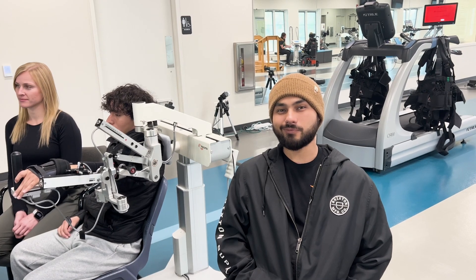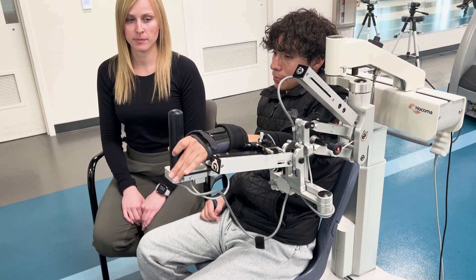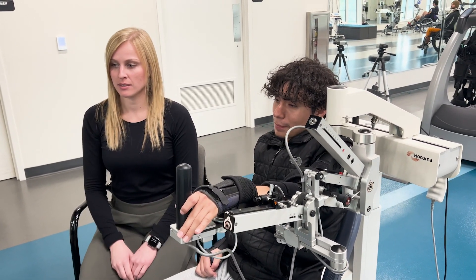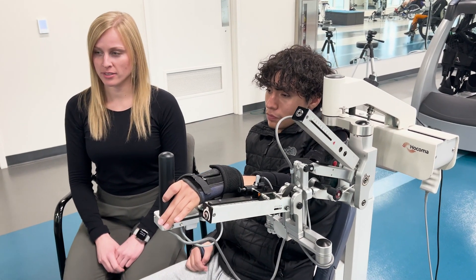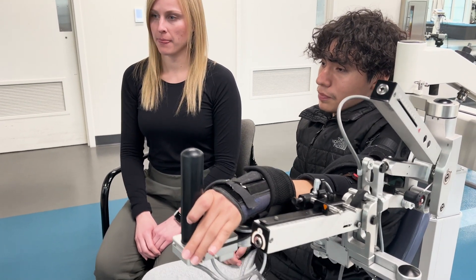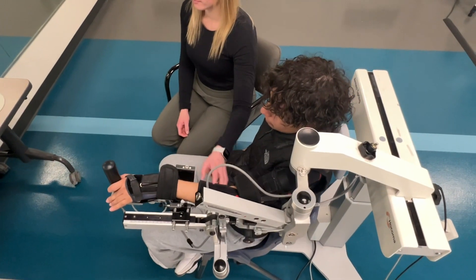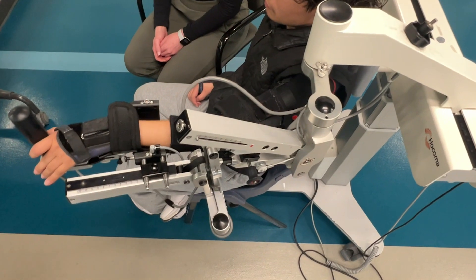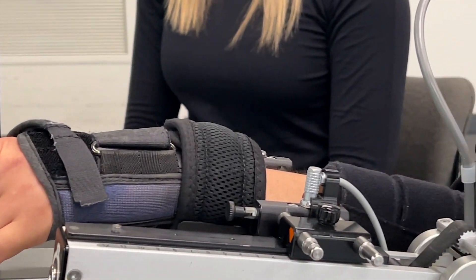Let's take a look at the Armeo. Hi, I'm Sarah and I'm an OT here at QLI. Hey, I'm Jose and I'm a resident here at QLI. This is the Armeo Spring. The Armeo is a bodyweight support upper extremity robotic device that helps to reduce the weight of the arm in order to move more easily through a range of motion. It provides a lot of mass repetition with engaging games in order to promote neuro recovery. The Armeo really helps take the weight off my arm, which helps me get better range and movement so I can go back to doing things like feeding myself and hugging my family.